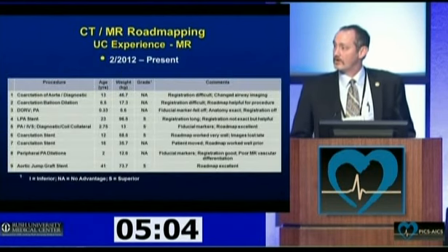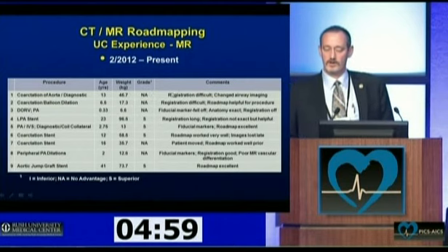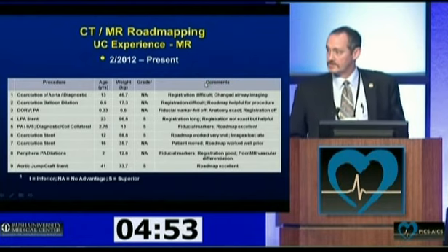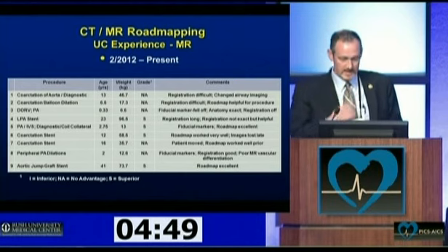Our results so far for MR overlays: we've had 9 patients. This started in February of this year when we got the newer prototype. The majority of our cases, at least 5 of them, were related to coarctations, including the extreme coarctation patient that we just showed the examples of.